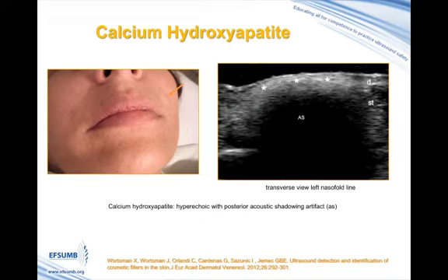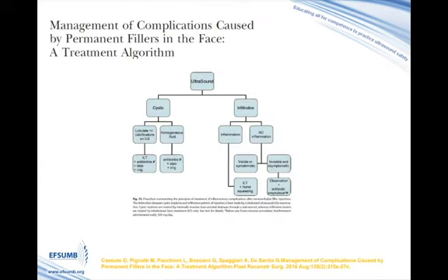Today, ultrasound is important for managing the complications of cosmetic fillers, as is well shown in this algorithm that is published in the literature.